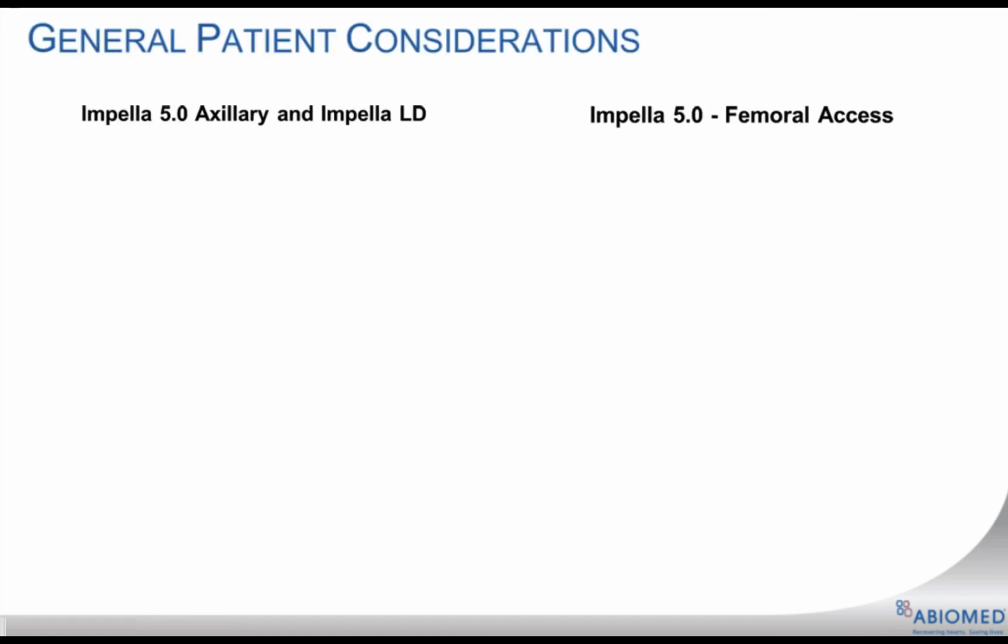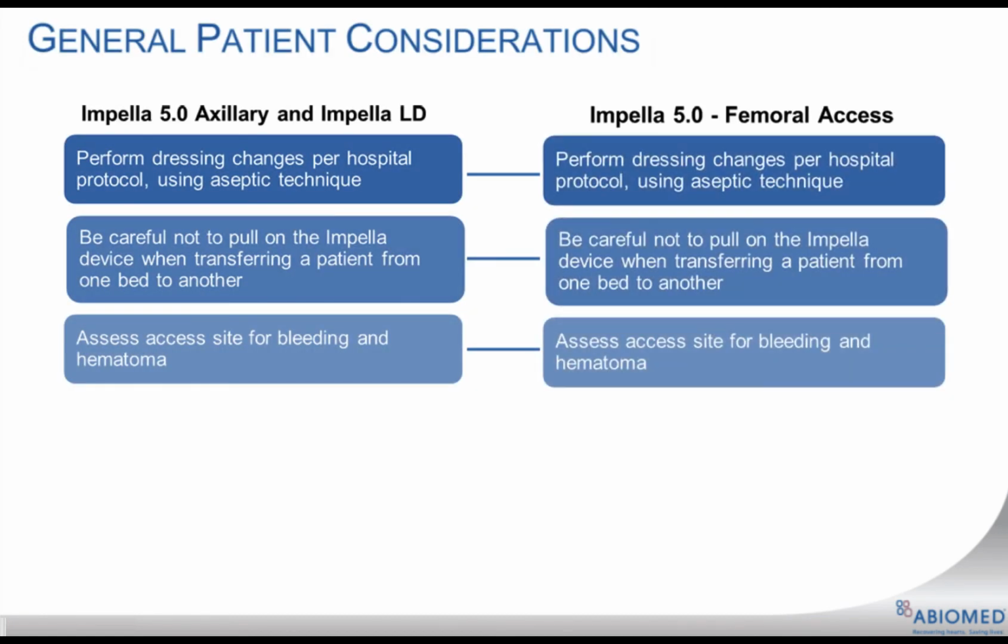When caring for a patient supported with the Impella 5.0 device placed in the axillary artery or LD catheter, perform dressing changes per hospital protocol using aseptic technique, and be careful not to pull on the Impella catheter when transferring a patient from one bed to another.